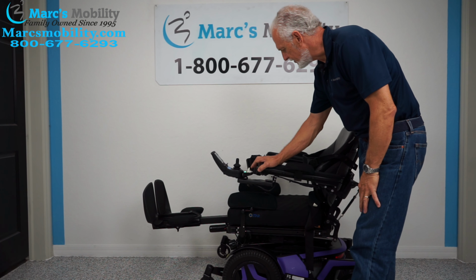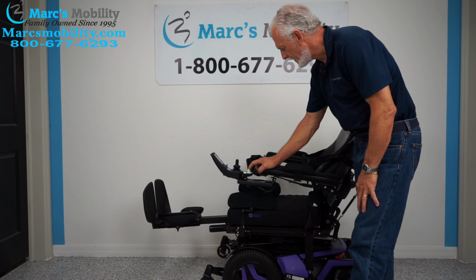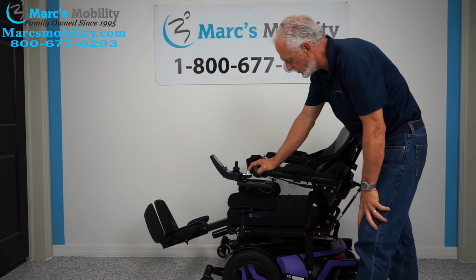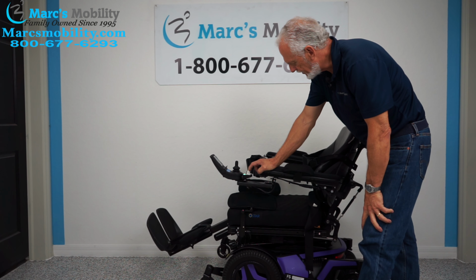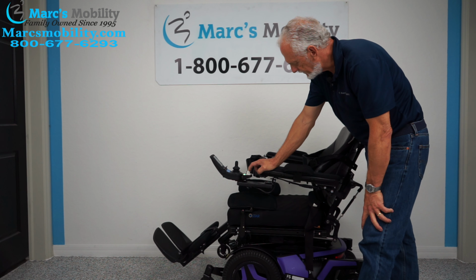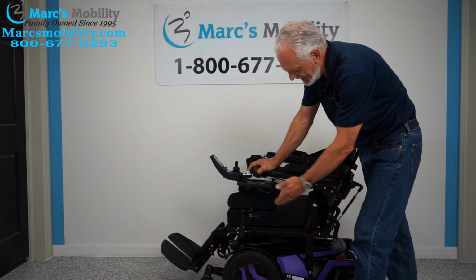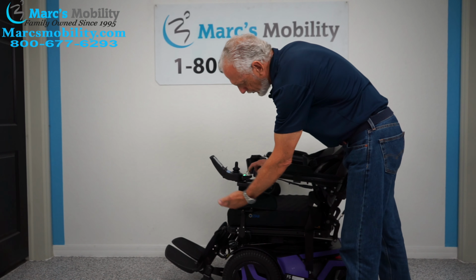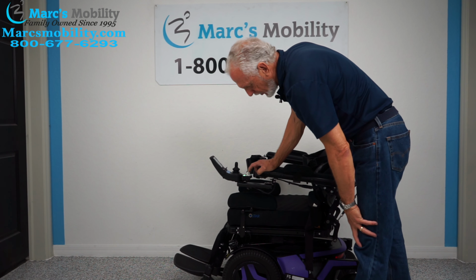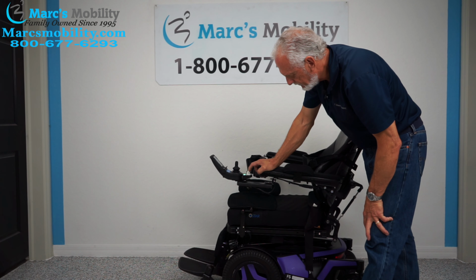So what I'm going to do is I'm going to bring the legs back down. And I'm going to show you the last 2 functions, which makes 7 electrical functions. So I'm going to bring the legs down. As soon as they get down, we'll go on to the next function. When you're outside, leave those legs out so there's a little more room under your feet, under your footplate. You don't hit the ground anywhere with a curve or anything like that.